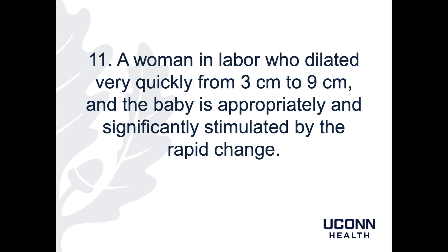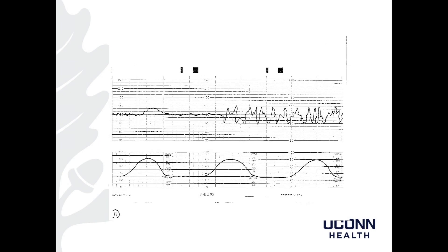Patient 11 is a woman in labor who dilates very quickly from 3 to 9 centimeters, and the baby is appropriately and significantly stimulated by that rapid change. My read: baseline of 120s. There is initially moderate, followed by marked variability. Accelerations are present, decelerations are absent. That would make this Category 2. You can really see the abrupt change in the fetus going from 3 to 9 centimeters, with all of a sudden very marked variability. This isn't concerning, but it was definitely a surprise to the baby.